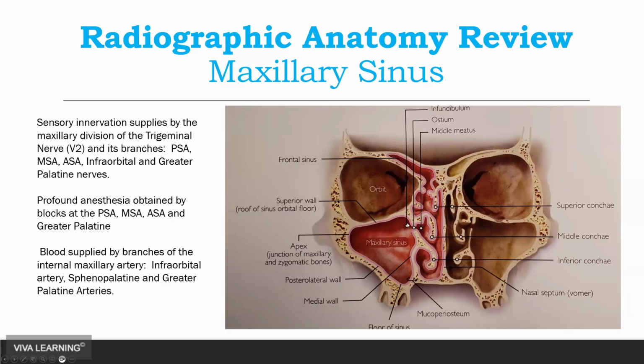And a lot of CTs that don't have a high field of view will miss that. They'll cut off the sinus about halfway. So even though you might say, hey, that sinus looks super clear, they have no symptoms, there might be a polyp or there might be some inflammation up in that osteomeatal complex that does not allow for any loose graft to escape, and that can cause infections.